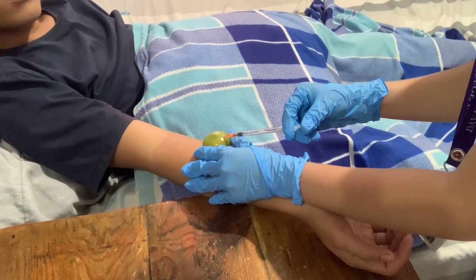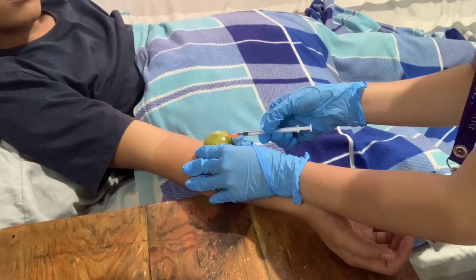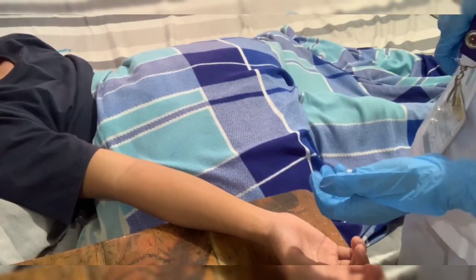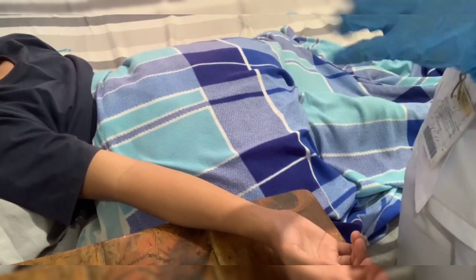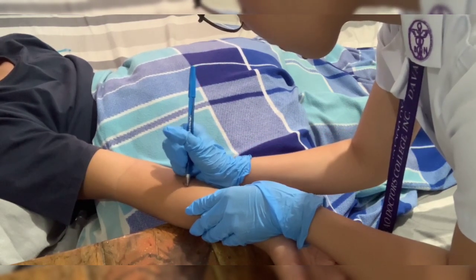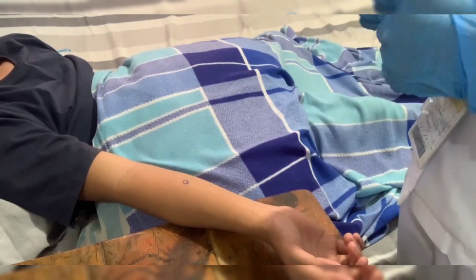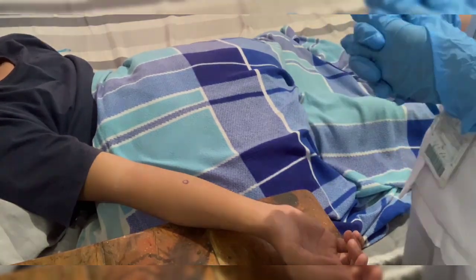Okay, so after that, we are going to withdraw the needle quickly at the same angle at which it was inserted. Okay, so now that we are done, we are just going to circle the area with our ink to observe the redness of the injection site. So sir, I have encircled the injection site, so please do not erase it or touch it later, okay?